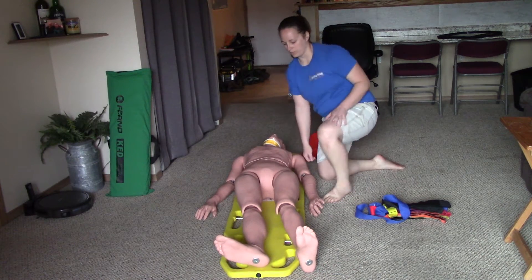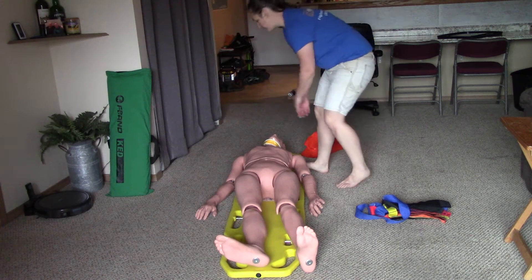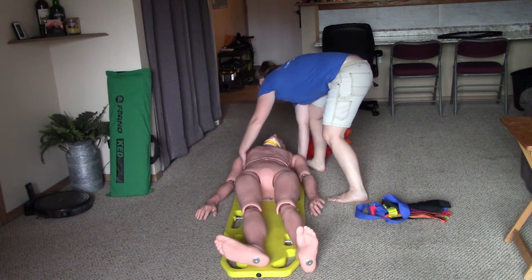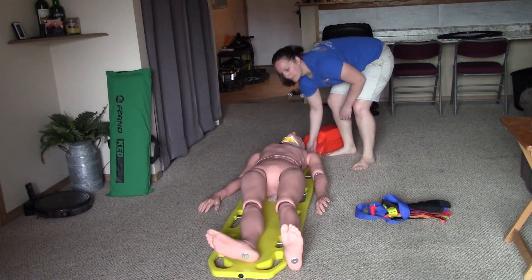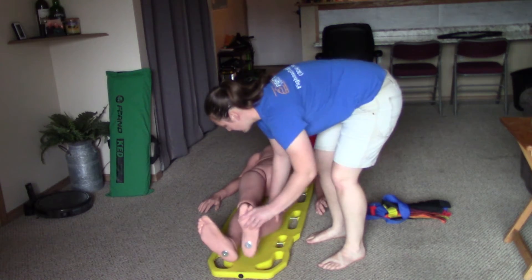I'm pretty close to having the patient right in the middle of the board where it needs to be. I'm going to slide the patient up about an inch to get their head just below the hole where it's supposed to be. On three — one, two, three. Straighten up the whole backboard, and I can pick up the legs and center those on the backboard.